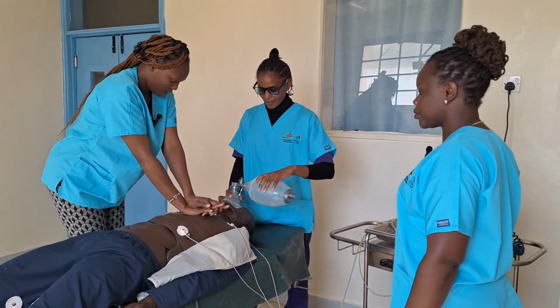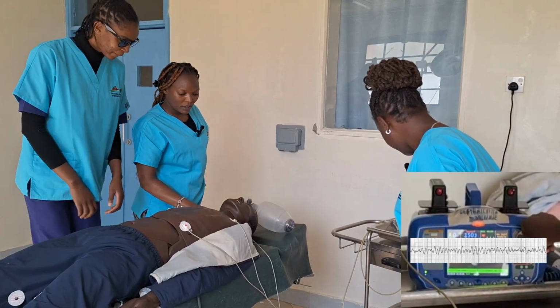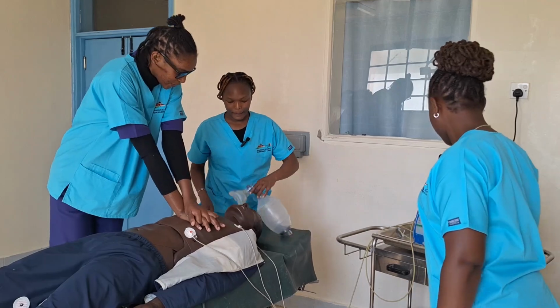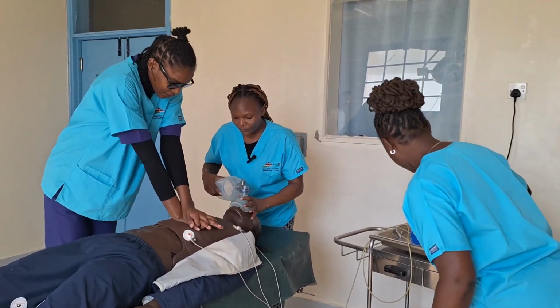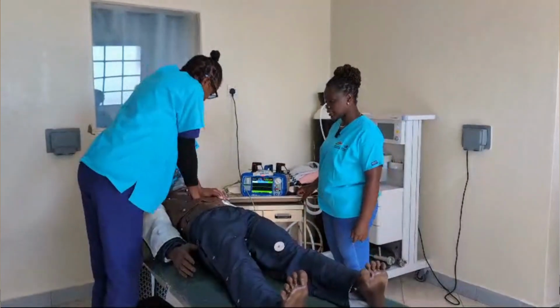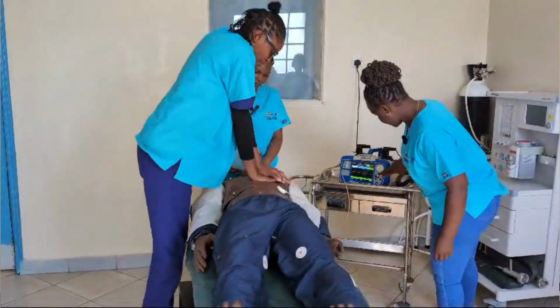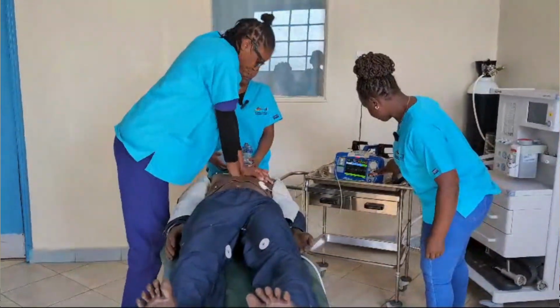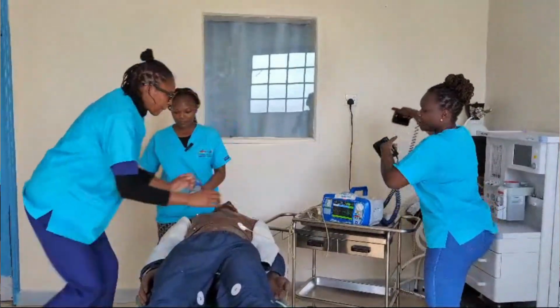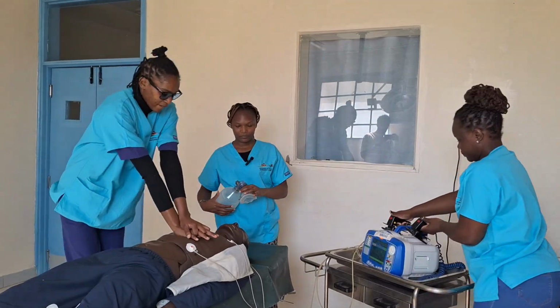Jackie will pause the compressions. Check for the pulse. I'm checking for the rhythm. We have a shockable rhythm. Do you have a pulse? No pulse. Continue CPR. We are going to prepare to shock the patient and also prepare to give the first dose of adrenaline. Defib charge to 360. I'll ask you to step away, oxygen off, step away. Shock delivered, continue CPR.